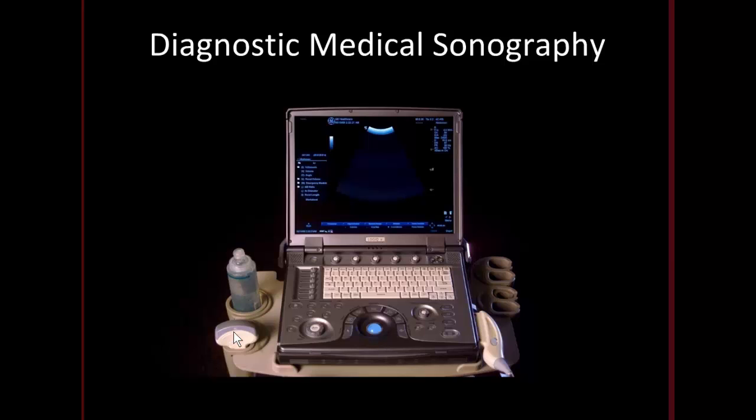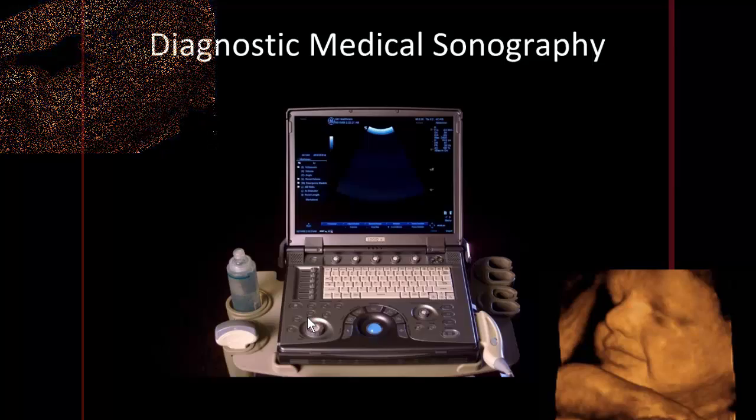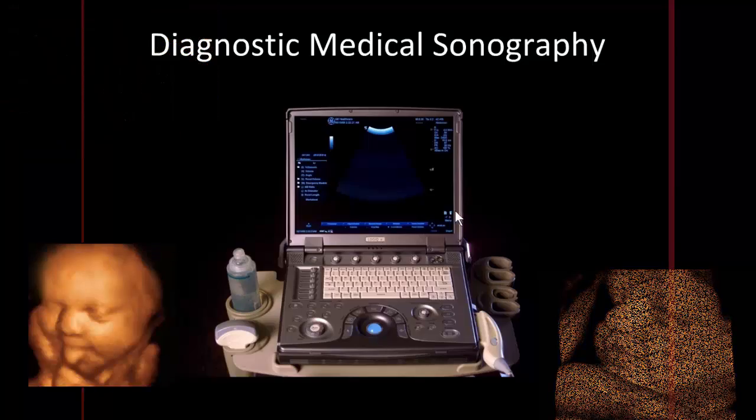Let me note here, actually, it's not only grayscale. Modern ultrasound has much more than just grayscale images. This is a pretty modern machine actually displayed here. Here you can set it to color flow Doppler, where you can actually visualize the direction that fluid is moving in, and some other very fancy modern machines will even allow you to do a so-called 4D ultrasound that gives you a three-dimensional appreciation of the underlying tissues and structures.